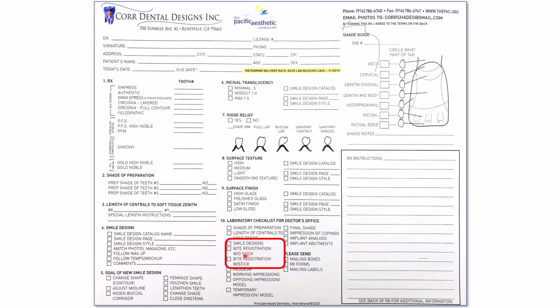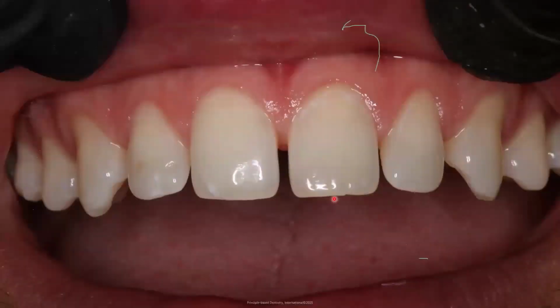We take a bite registration, maybe with a stick. So if we have to level out the occlusal plane, we take a stick bite that has a vertical and a horizontal stick on it, so the lab knows where to level out the maxillary occlusal plane. And then anything else miscellaneous we put over here. So if you say, hey, I want tooth number 7 and 10 not to be symmetrical, or whatever you want, you would just put that over there.